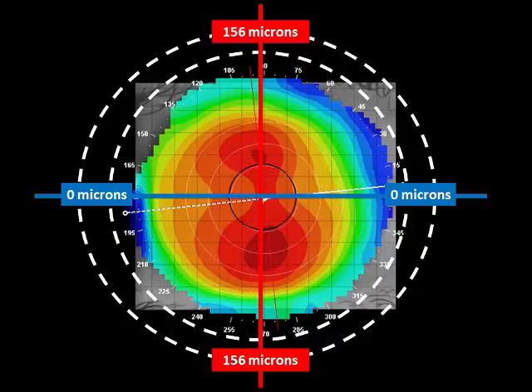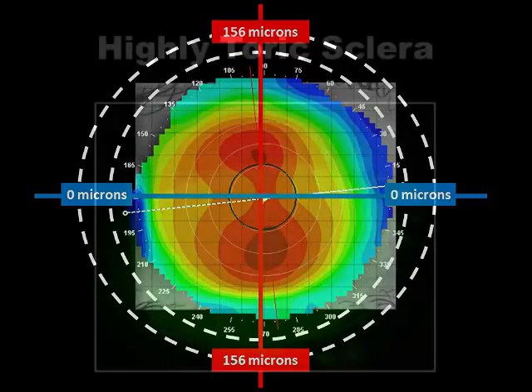Now that would indicate that when we place a scleral lens on eye, it should land at 3 and 9 o'clock and it should lift at 12 and 6 o'clock. But of course, scleral lenses sink into the soft conj, so it's going to compress and eliminate a lot of this fluid at 12 and 6 o'clock. So that's why you can usually fit a patient with a symmetrical scleral lens. You don't need a toric.